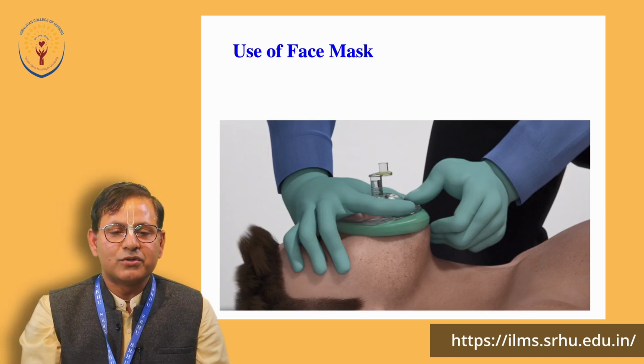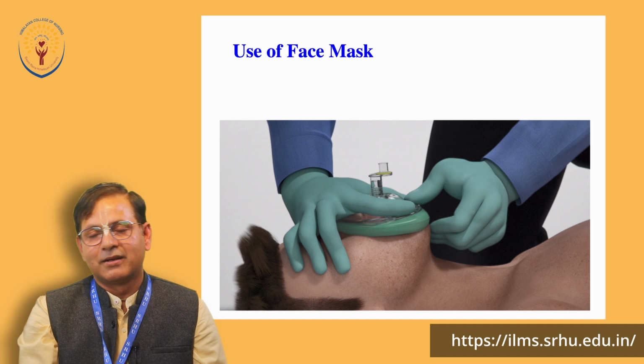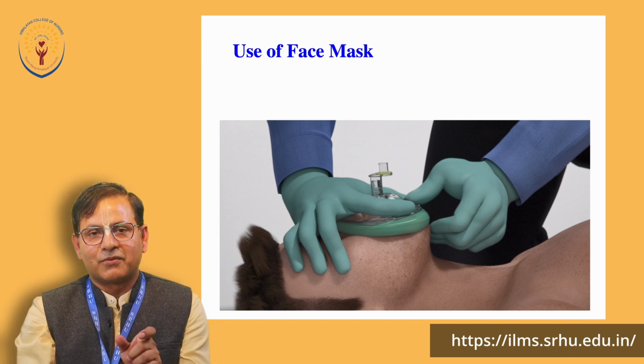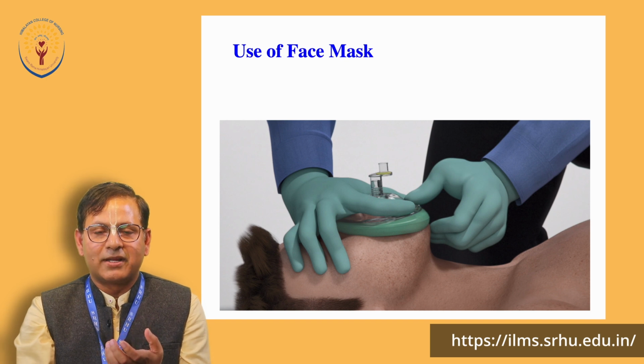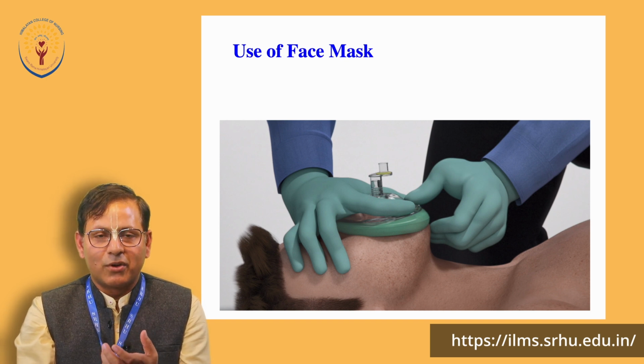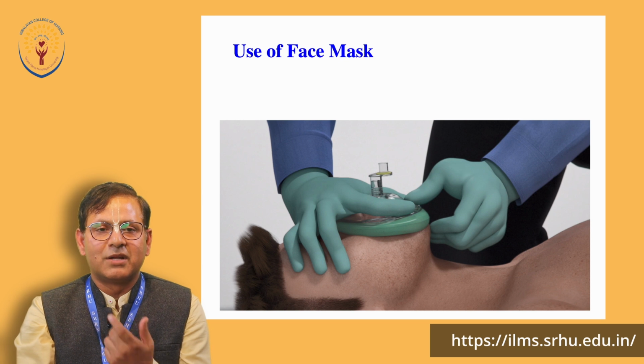So, this is how we use the face mask. We have to see that the notch of the face mask has to be on top of the nose, and the wider area has to be down, where it has to cover the whole mouth with the lips actually.